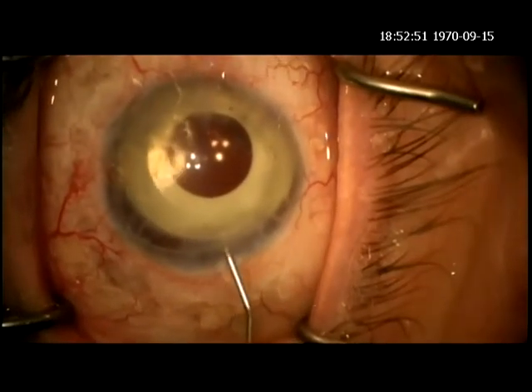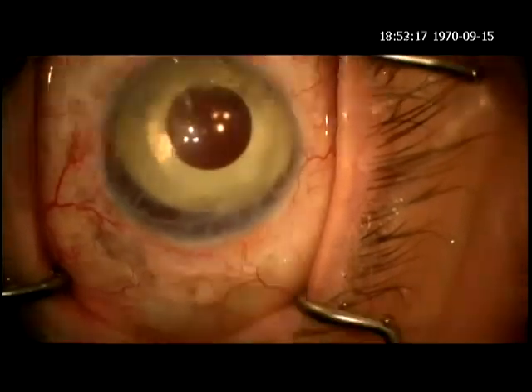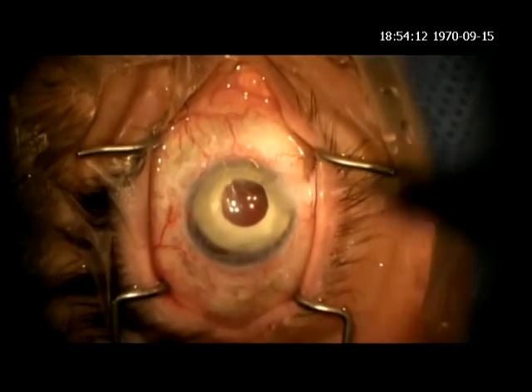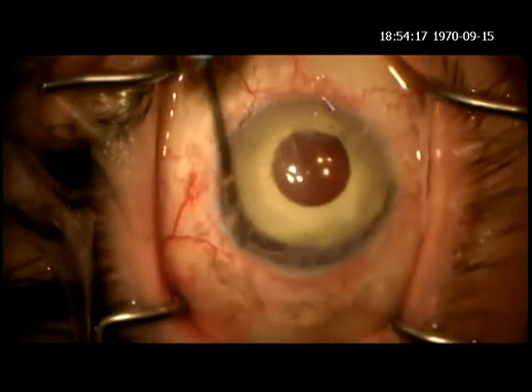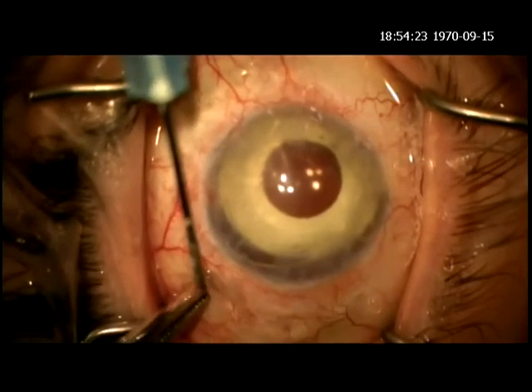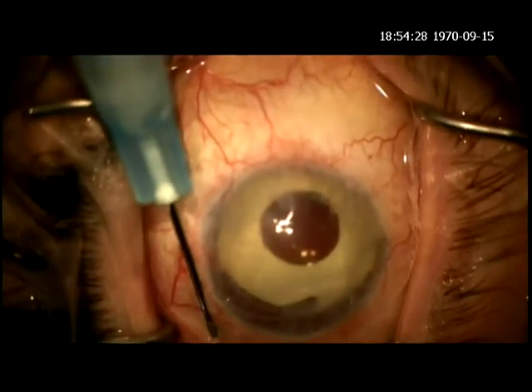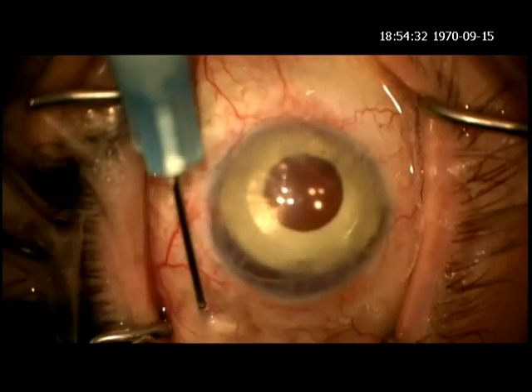Current on-label approval of the Cypass is very limited, but the power of this device is easy to underestimate. As the father of the anterior approach cyclodialysis, I want to tell you this is real glaucoma surgery. From over 20 years of experience with the anterior cyclodialysis procedure, I believe it will be clear that the pre-op IOP is an independent variable from the post-operative IOP, and that patients with pressures preoperatively of 50 attain the same results as patients with pre-op IOPs of 17. Thank you.